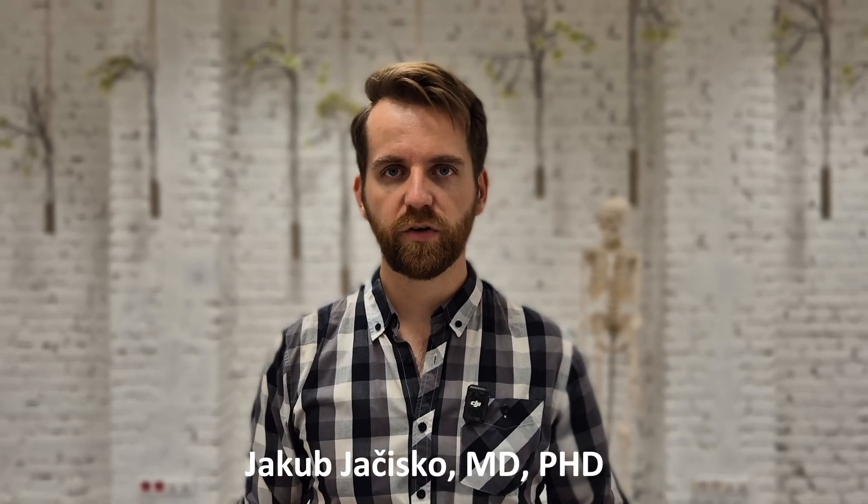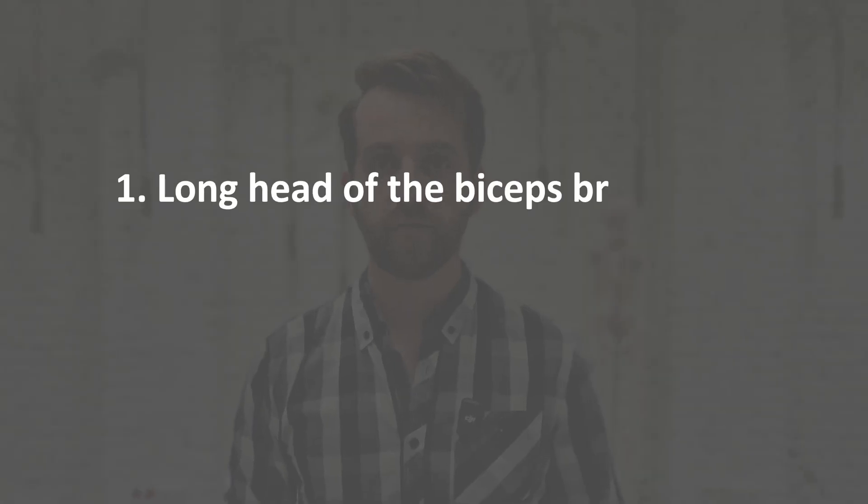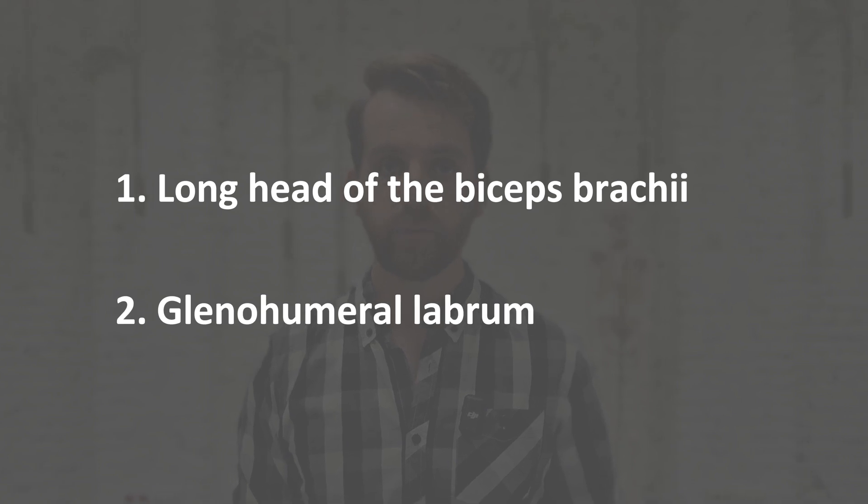Hi, my name is Jakub and I'm a physical medicine and rehabilitation specialist. In this video we will focus on shoulder effusion, specifically how to find the fluid around the long head of the biceps brachii and around the labrum.